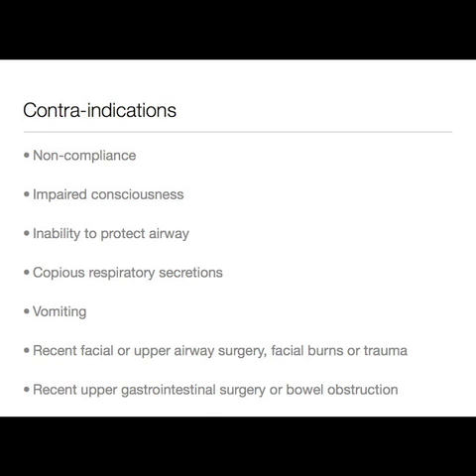Recent facial or upper airway surgery, facial burns, and trauma are contraindications for the use, as the tight-fitting mask can cause further damage, necrosis, and pressure sores. The positive airway pressures can cause gastric distension, and for this reason, NIV is not used where there has been recent gastrointestinal surgery or bowel obstruction.